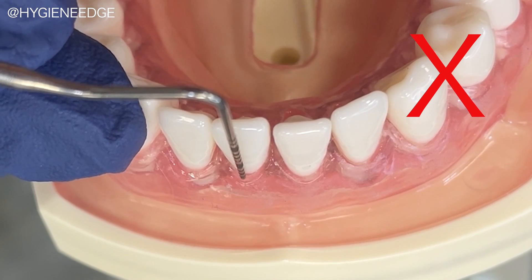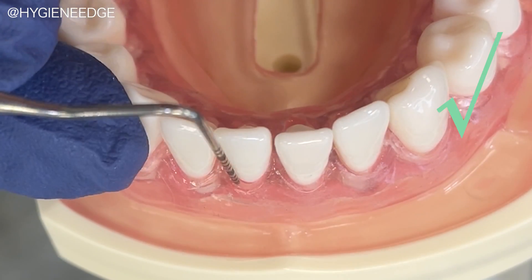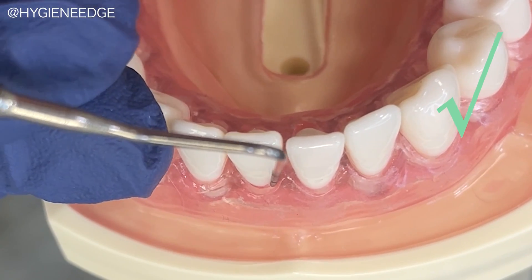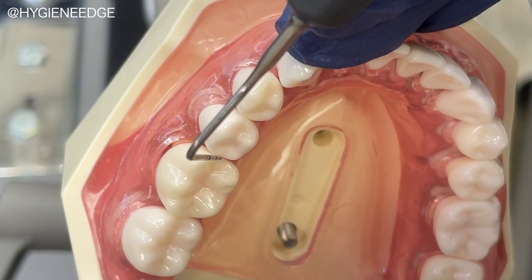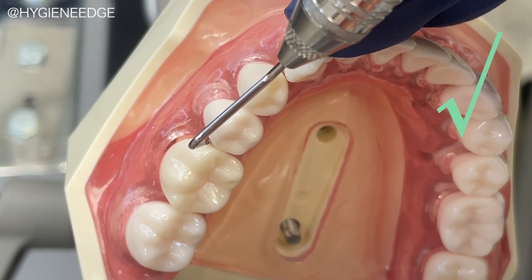A typodont really helps you to learn to keep the working end parallel to the triangular root surface, meaning it should tilt at an angle into the pocket. If you're not parallel, you'll notice that your probe is not inserting into the pocket. One last common error is tilting it too much into the col or not tilting enough into the col. Envision extending the probe halfway across the tooth proximally.